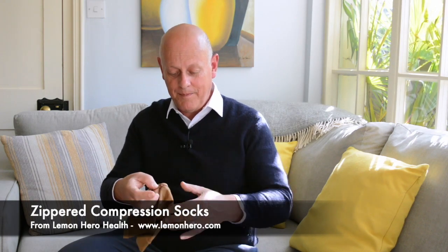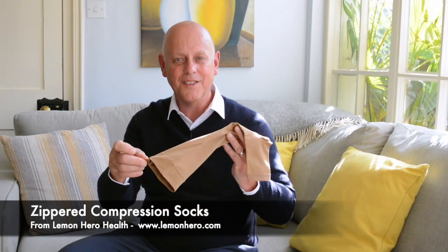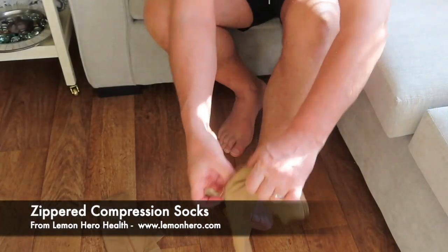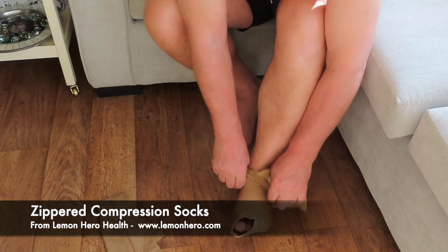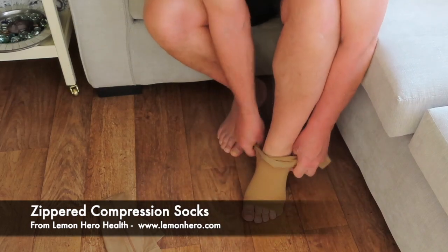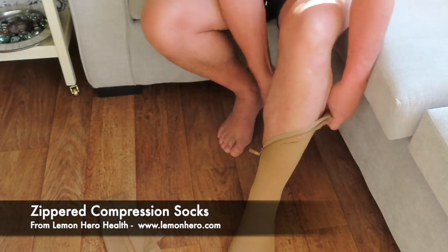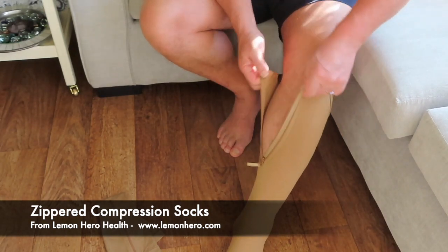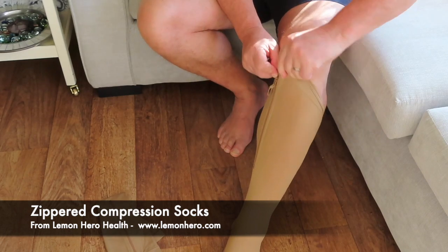You simply unzip them, put them on your foot, and then zip them up. Let me show you. I simply slide it on and zip it up. If necessary, hold the zipper sides together with your hands as you zip. And there it is.